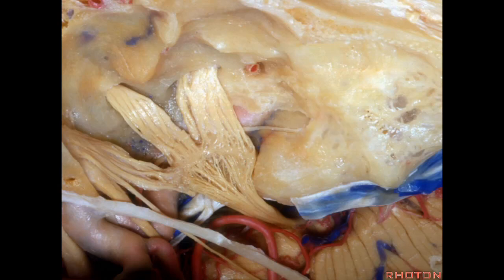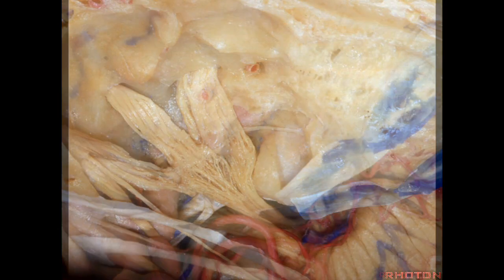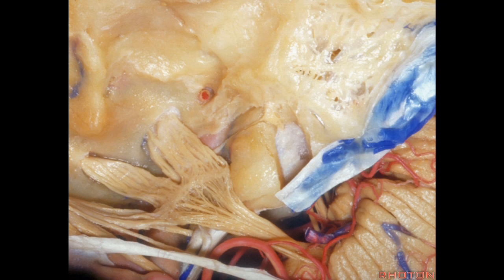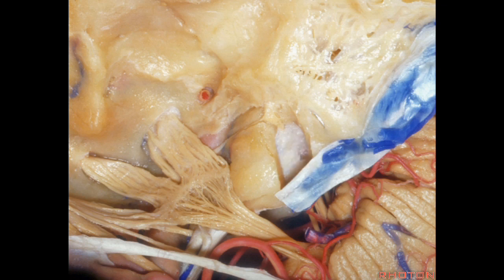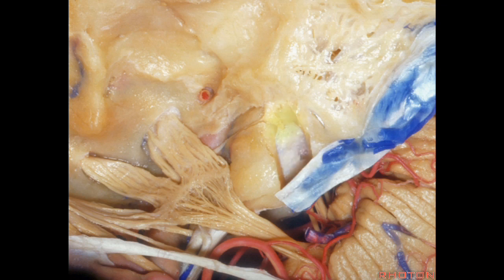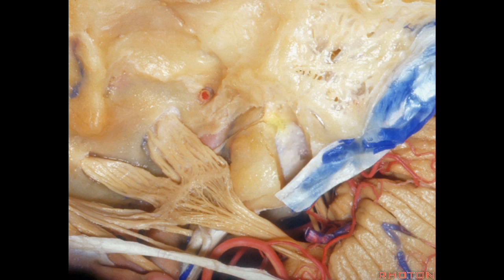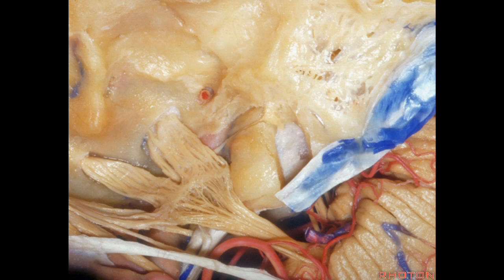The drilling is going to be very tight. We've drilled now from porous to fundus. We see here what segment? The labyrinthine segment.